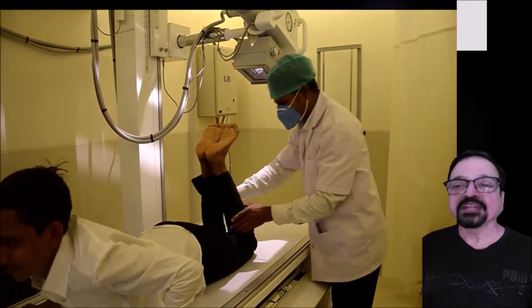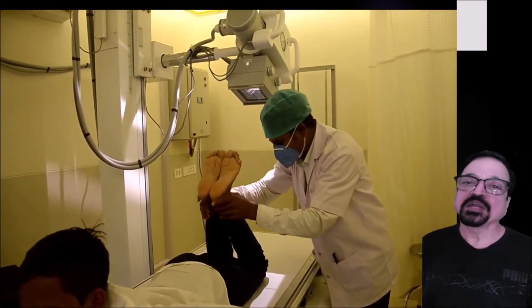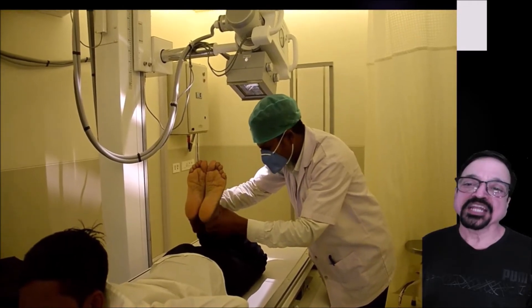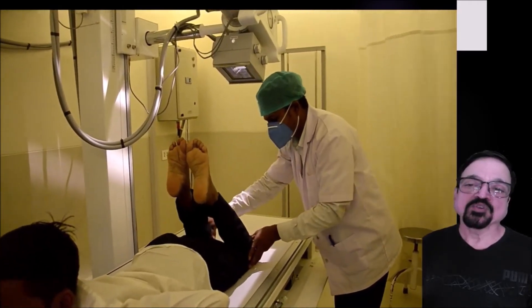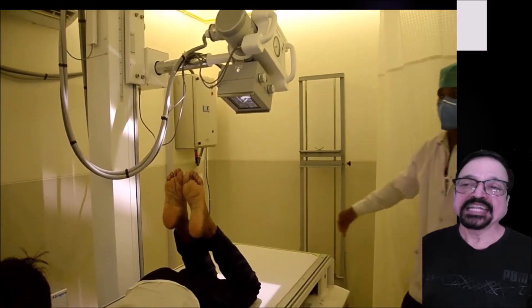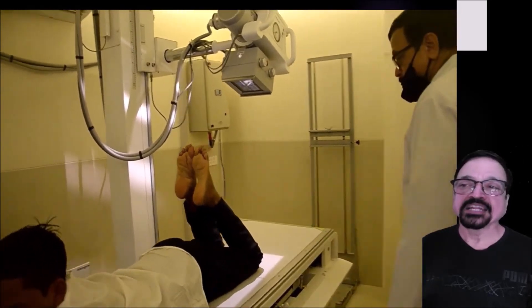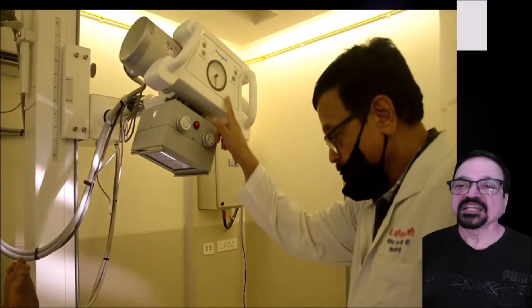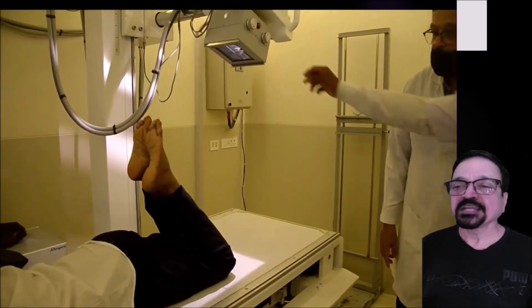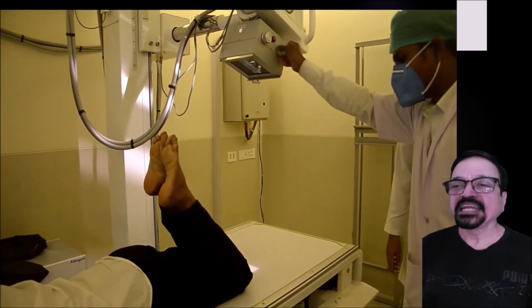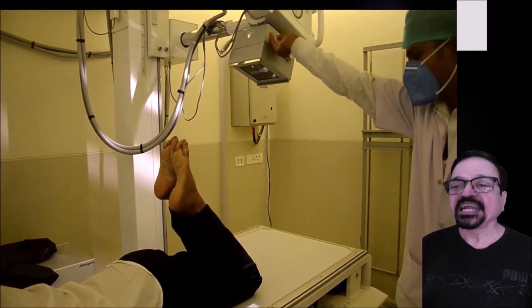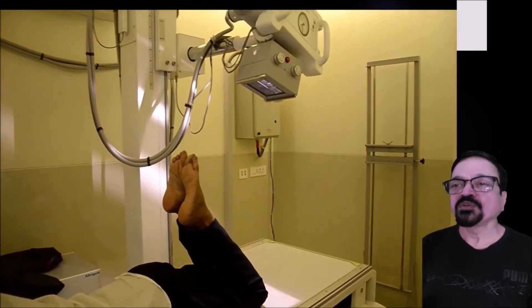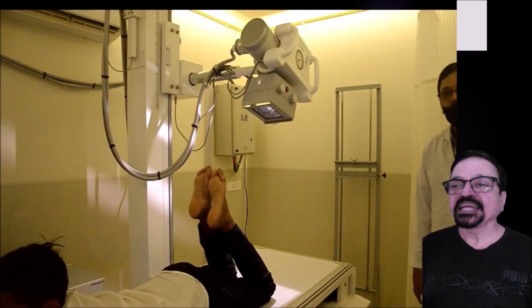There are many techniques in which this X-ray can be taken and you can modify the technique for other positions. The patient must be cooperative. Here both feet are held by the patient. Everything is checked — angle is correct, distance is correct, cassette is placed properly — then the collimator is adjusted so that unnecessary anatomy will not be irradiated. With all these checks done, you expose the film and take the radiograph.